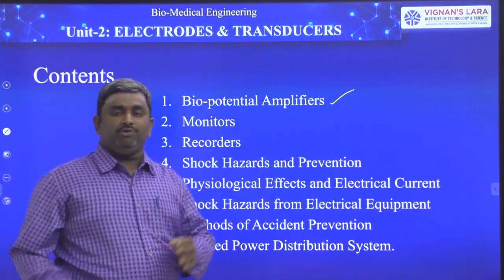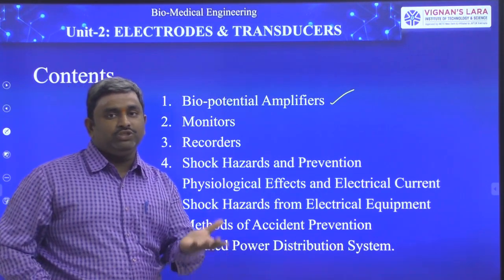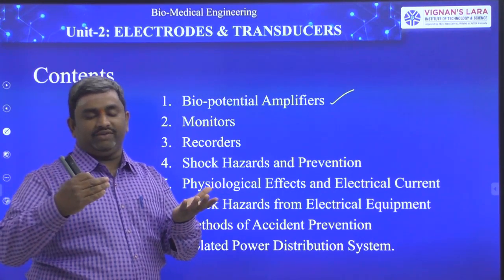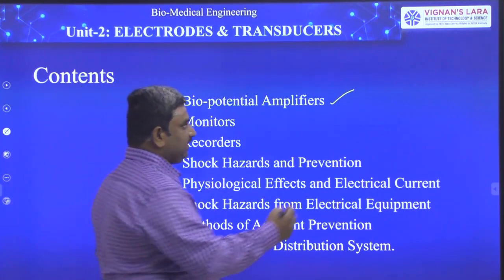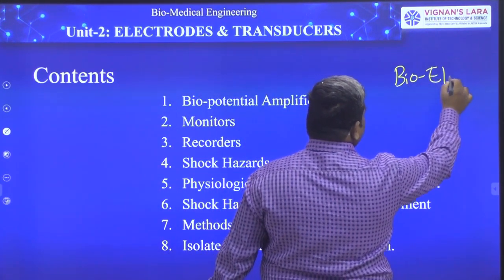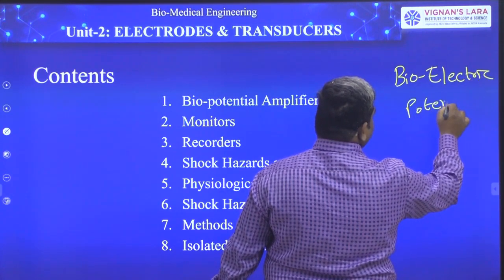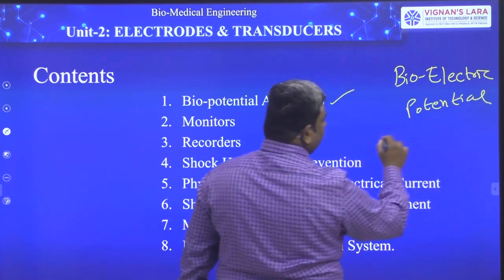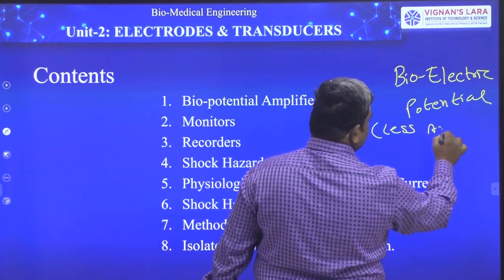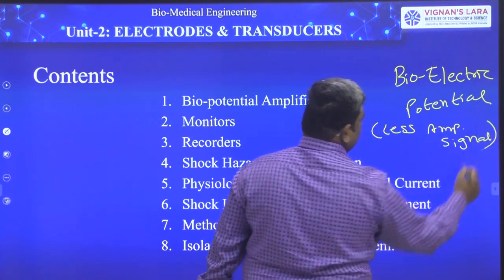A biopotential amplifier boosts up the signal energy. Otherwise, we can say that a bioelectric potential is a low amplitude signal, right?